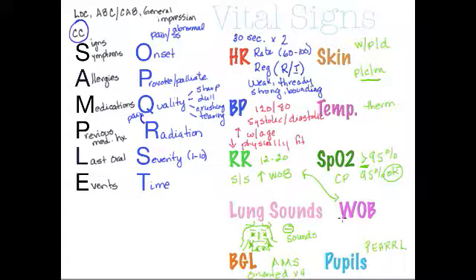For respiratory rate, a good way to get that is you can get the patient's pulse and then continue to watch their chest rise as you act like you're obtaining a pulse, because oftentimes if people know that you're tracking their respiratory rate, it will just get altered. You can even place your stethoscope on their chest and listen to them breathe. You can also place your hand on their chest or back to feel for the rise and fall. So those are just some helpful hints, and we will definitely be working on these skills quite a bit.